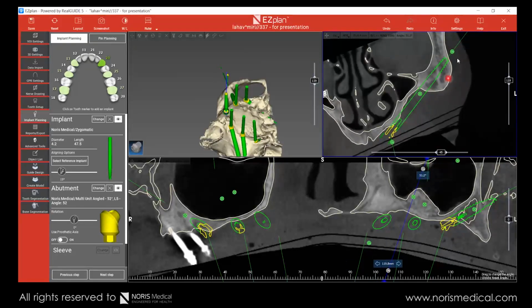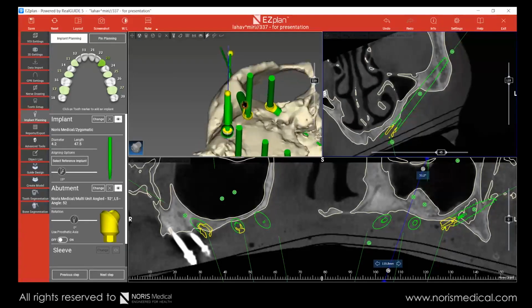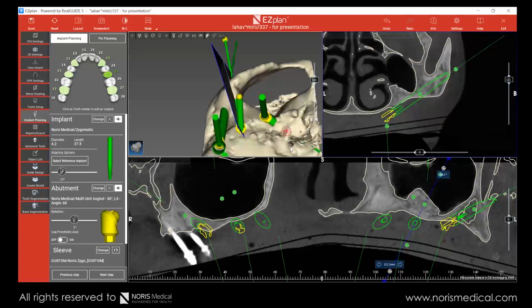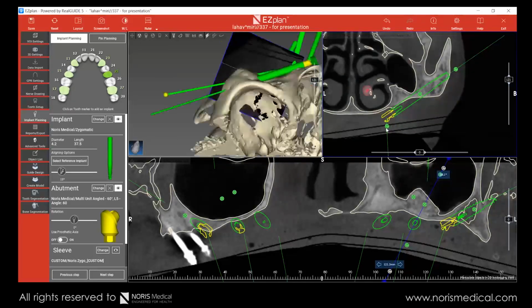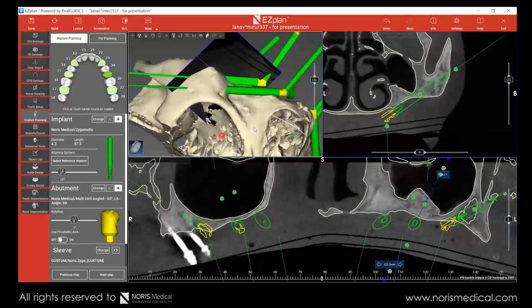Okay, but we do have a very strong zygomatic bone that will take this moment here. It's very strong, it's very long. This will hold. I'm not afraid of this not being supported here. Okay, let's look at the posterior implant. Let's try to do it again without looking here. Let's try to position using the parallel view.